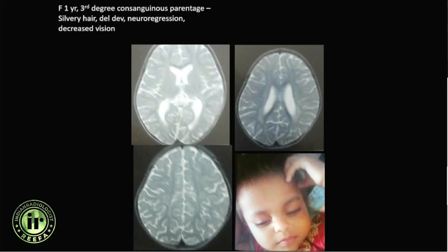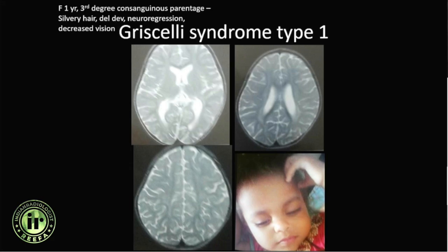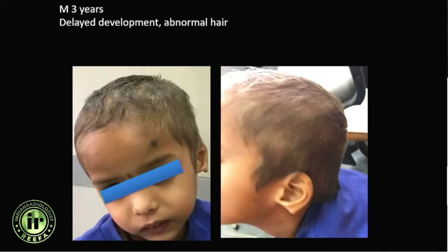Apart from neurological symptoms, other clinical history is important. Another patient with consanguinity and abnormal silvery hair showed diffuse periventricular signal abnormality and decreased vision. This was Griscelli syndrome with silvery hair.